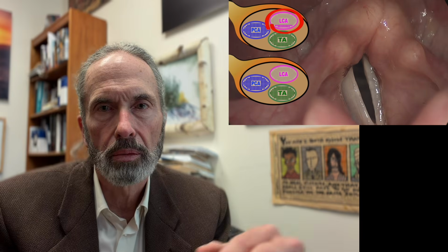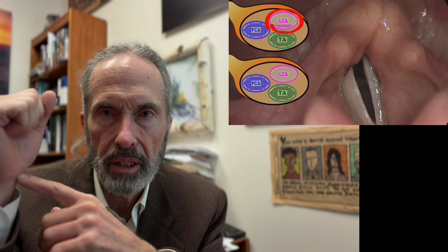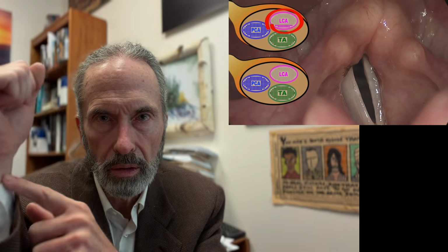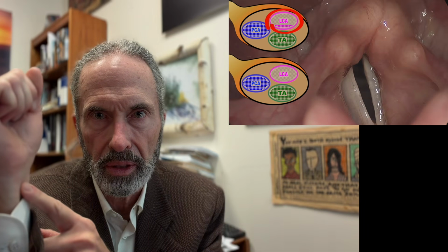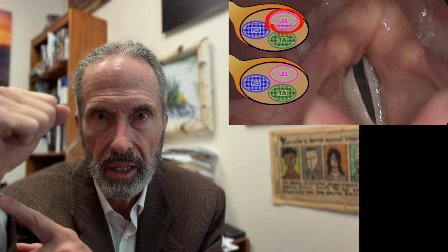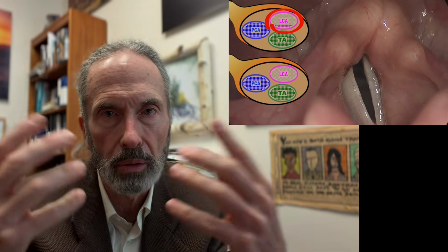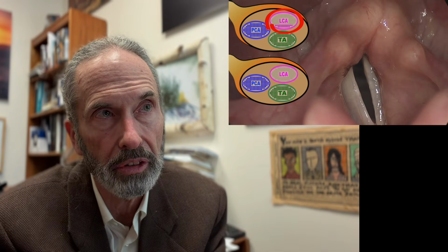And when we're watching the right vocal process, we're not only watching, does it get to the midline, but does it get to the midline by rotation? And in this case, I think it's going not to the midline, but it's getting pulled, and actually it's never rotating. It's being pulled over, and it's being pulled over incompletely. So I'll give 2 hypotheses here.